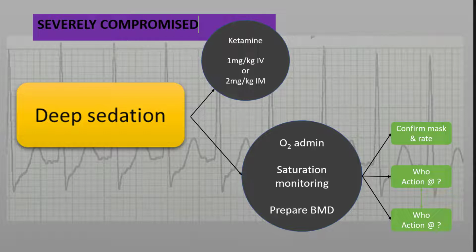Having chosen the appropriate pathway, the next phase of execution is to prepare the equipment and the patient. For risk mitigation purposes, team members should know who is responsible for which tasks need to be undertaken. So this information needs to be known by the entire team.